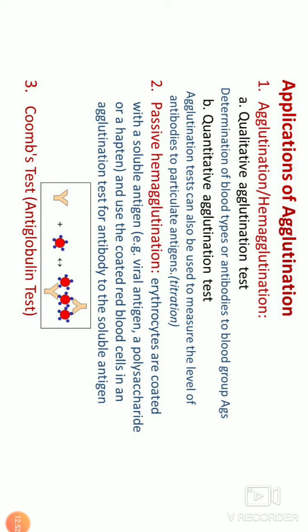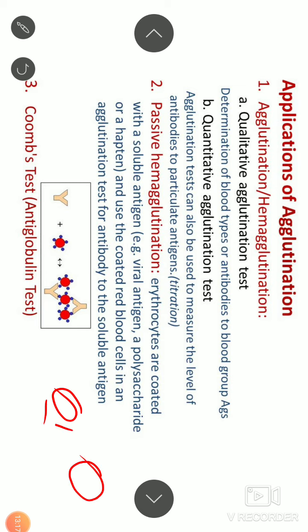The Coombs test is based on two important facts: that antibodies of one species are immunogenic when injected into another species, leading to production of anti-immunoglobulins, and that many anti-immunoglobulins bind with antigenic determinants present on the Fc region. So you have the erythrocytes. Now you already have antibodies which are bound, but these are not agglutinating. So you put the secondary antibody. This is the Fc region, right? This one, the Fc region, and then you see the agglutination.